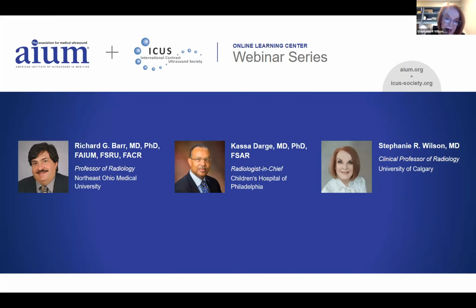And I will add that even my brief exposure prior to 2007 showed that this is an excellent technique for looking at aortic grafts, especially when you consider the age of the patients and the status of their kidneys. Currently they've been having CT scans for surveillance, and of course it is much more optimal to do this with CEUS, and the results are superb.